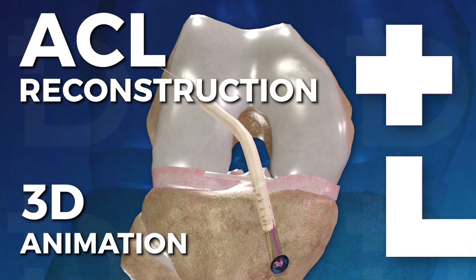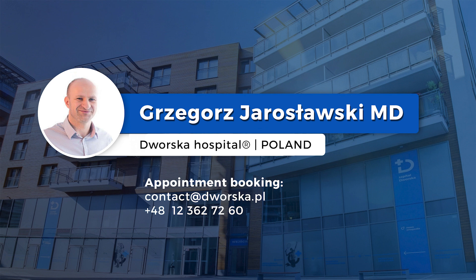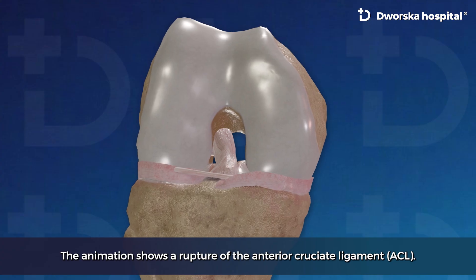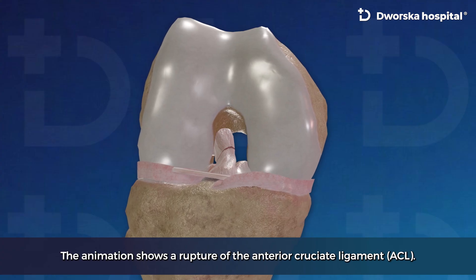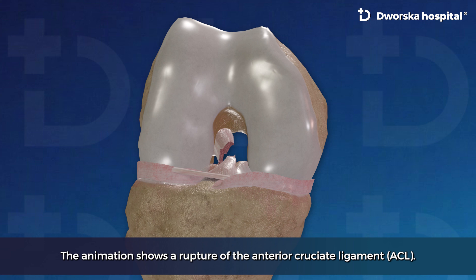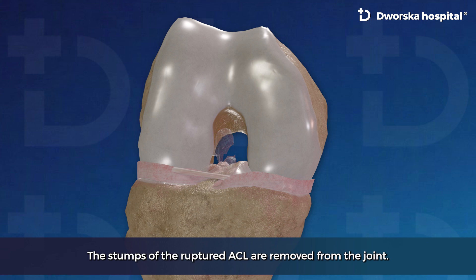ACL Reconstruction Procedure according to preferences of Grzegorz Jarosławski-Dworska Hospital. The animation shows a rupture of the anterior cruciate ligament. The stumps of the ruptured ACL are removed from the joint.